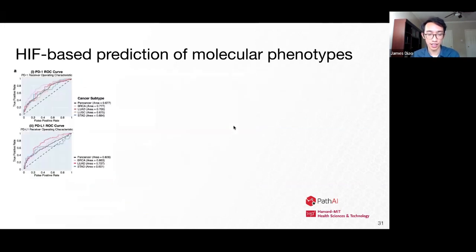And then here's the outcome for PD1 and PDL1. These are the ROC curves. The overall splits, even though they're not guaranteed to be 50-50, are generally not that far off. So we felt that the ROC curve was appropriate, although we also do have PRC curves as well that I'm not going to show today, but are in the supplement of the paper.